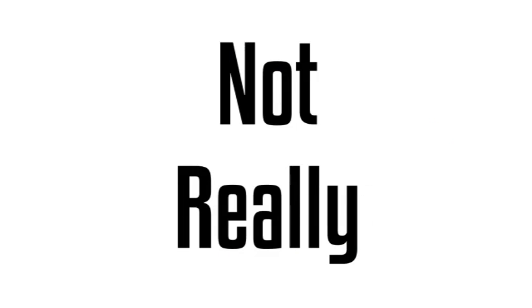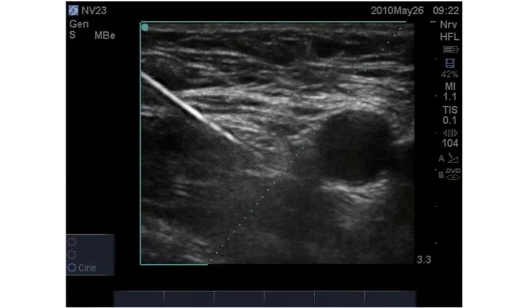The other thing that people worry about is nerve injury. It turns out not so much — especially with ultrasound guidance. We're probably not going to hit the nerve. In this block, you don't even have to get all that close to the nerve, so there's no reason to think you're going to injure the nerve. We've been doing these blindly forever with nerve stimulators or just poking around — you're definitely hitting the nerve — and we don't have reports of a lot of complications even with the blind technique.